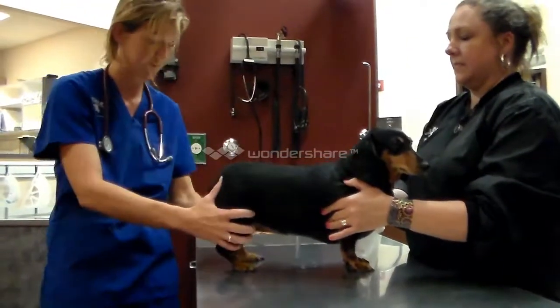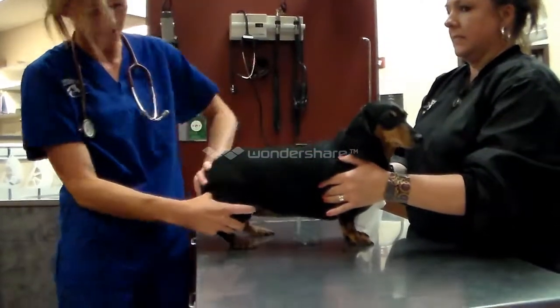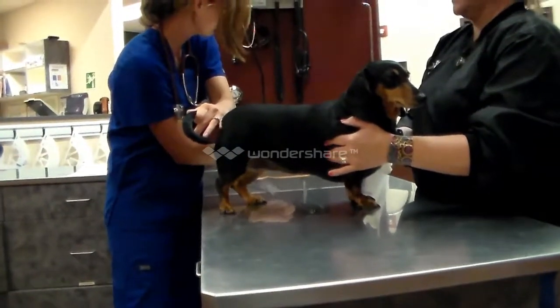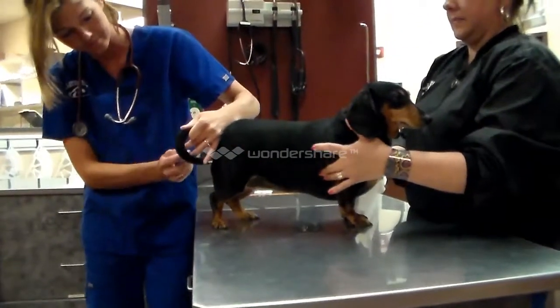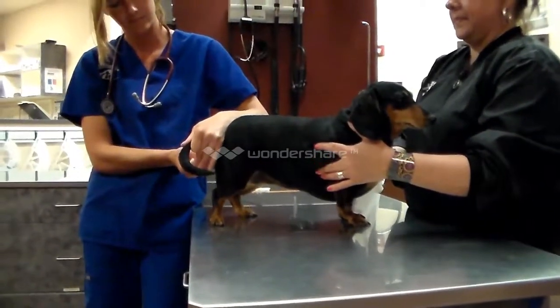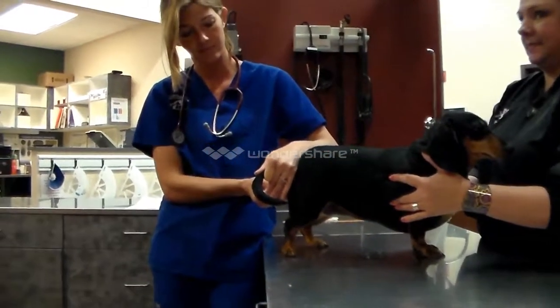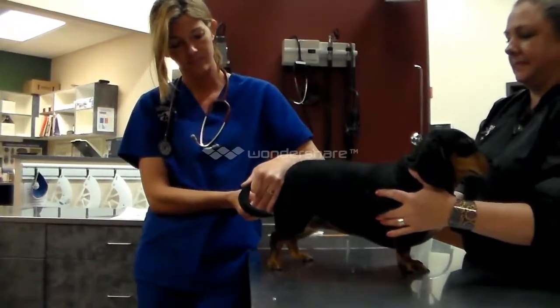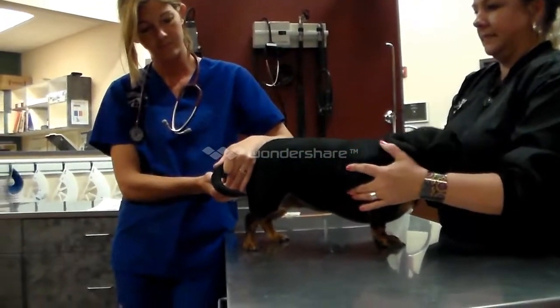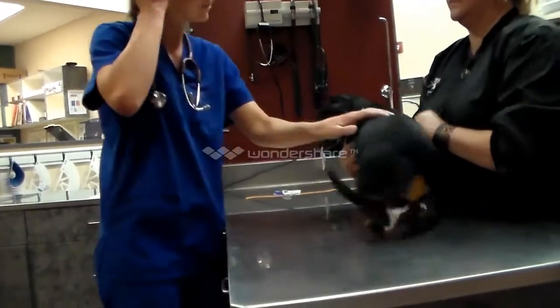Skin and coat looks good. I don't see any evidence of fleas. Feet and her nail beds look fine. Go ahead and get her temperature while we're back here. Temperature is 101.5, perfectly normal.